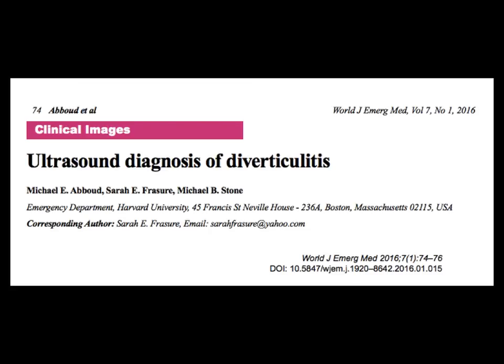Those are patients in whom I think you should still do a point of care ultrasound to look for diverticulitis, intra-abdominal free fluid, or another cause for the patient's pain, particularly if they are unstable. But these are patients who will probably also need CT imaging and hospital admission.